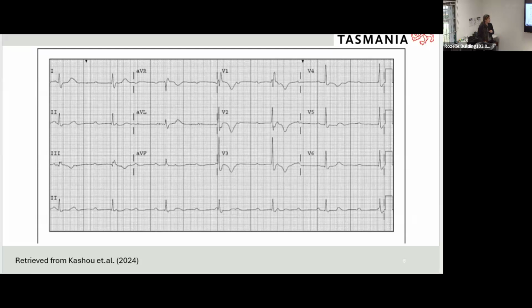So to start off with, where do we start with our rhythm interpretation? Does anyone want to pop into the chat? Great, perfect. Got rate rhythm coming out from Chloe on chat. So I had an email from someone about the best methods to interpret the rate. What's everyone's favorite method to do and why?